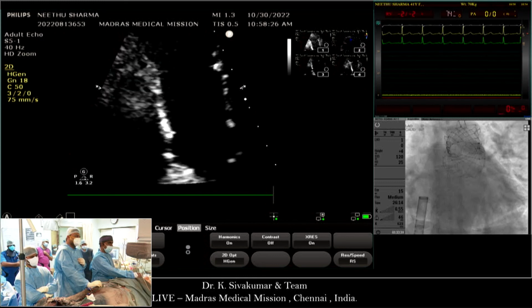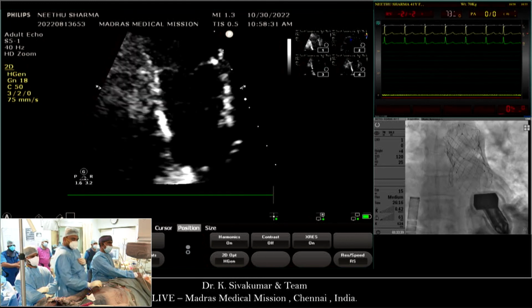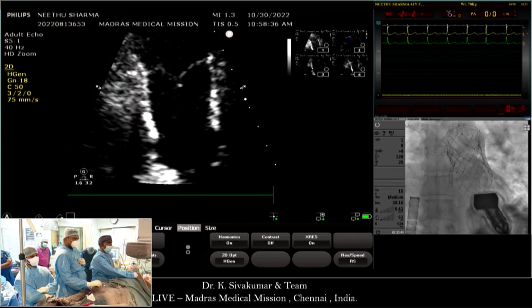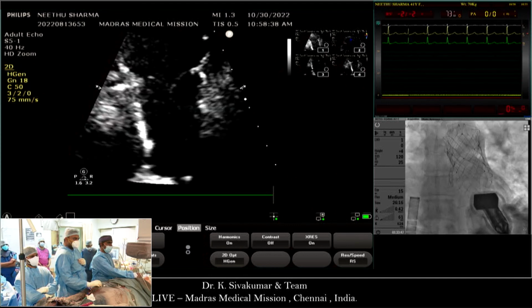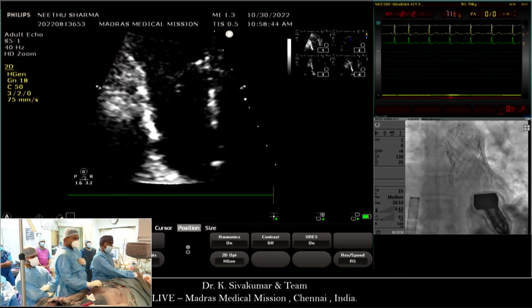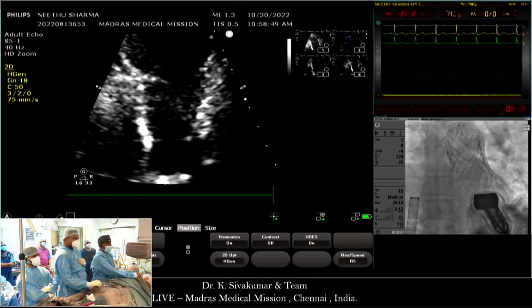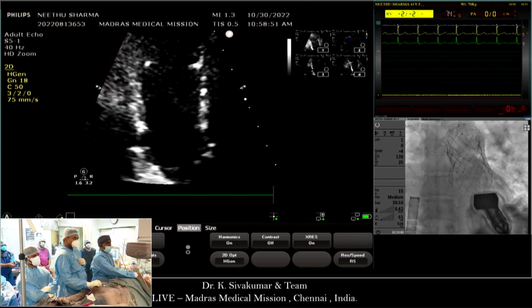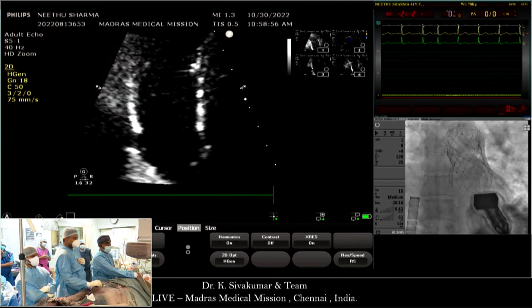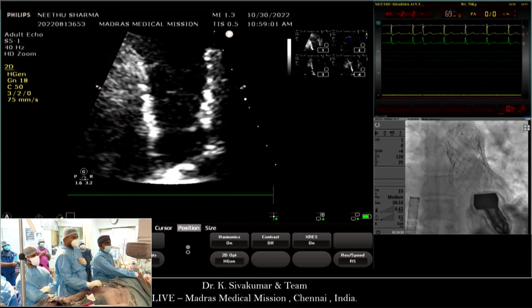I think there are tiny air bubbles trapped in the pulmonary valve leaflets, which gave that mobile appearance. You see here now also, an air bubble is getting trapped in the pulmonary valve because the patient is in a lying position. Do you think so? Well, I'm not sure about that, but I hope you're right for the patient's sake. The material is definitely more distinct than the leaflet. Have you checked the ACT, Shiva? We have sent it, we are waiting for it. I think it's moving too much. It's probably a micro air bubble, which is powerfully illustrated by the echocardiogram because of the reverberations. Then you could do another angiogram in the right ventricle, and that should move it.